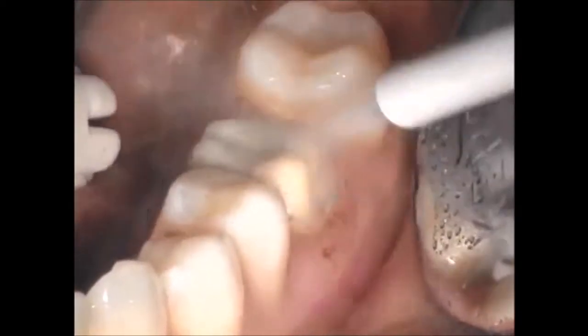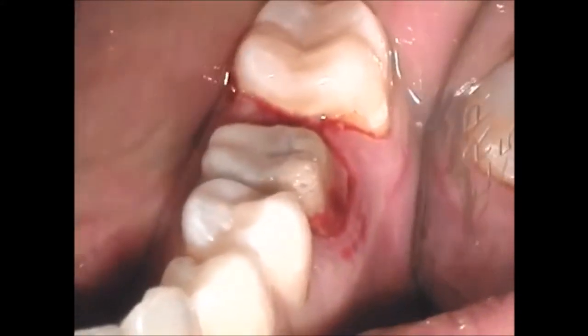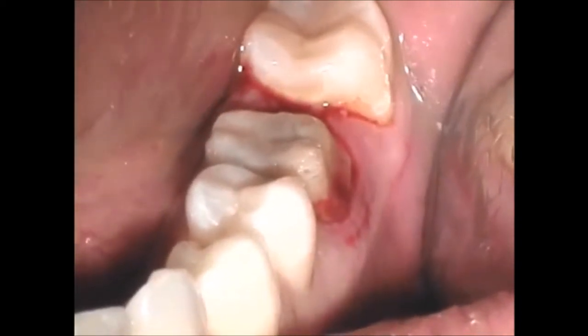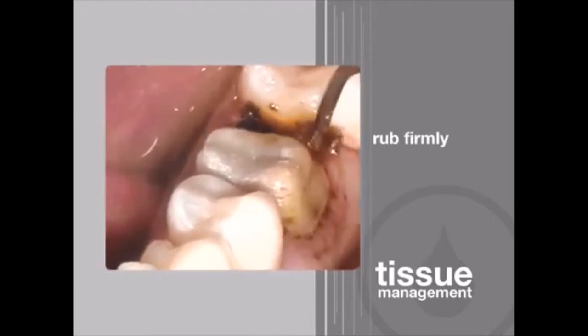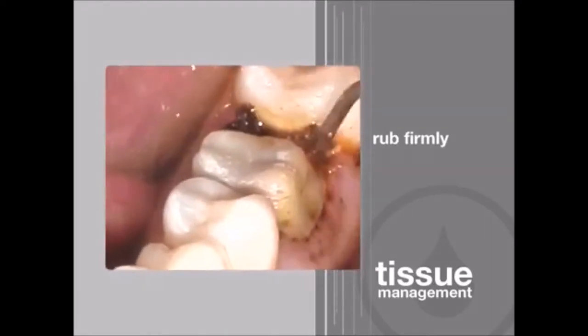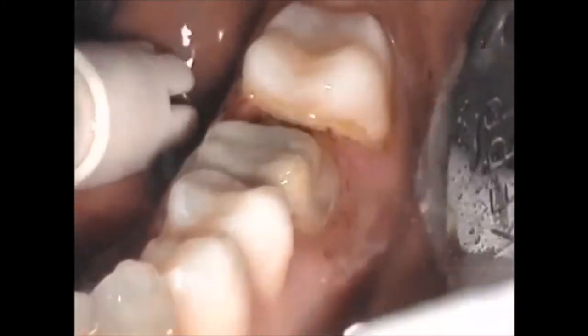To test for completeness of hemostasis, the sulcus is cleaned with a firm air-water spray. Remember, if bleeding is the tissue's response to a firm air-water spray, then bleeding will probably also occur during placement of the impression material. Therefore, if bleeding occurs, more Viscostat should be burnished firmly against the area.